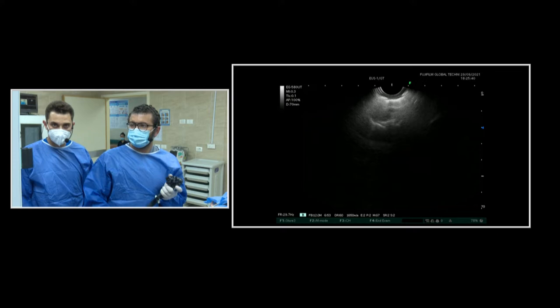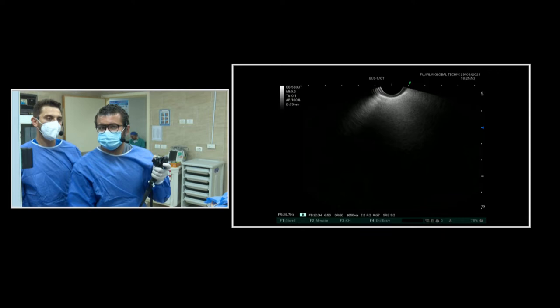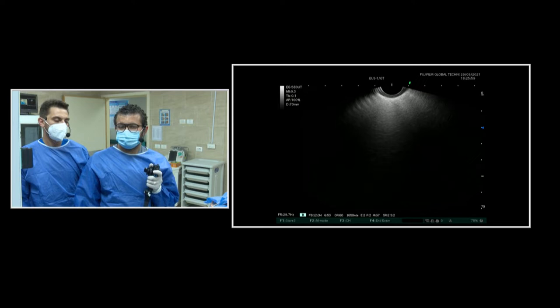So I referred this case to my colleague Dr. Yunan. Good morning, Dr. Yunan. This case, as I said, was referred for ERCP for obstructive jaundice. We saw the papilla — it was suspicious, it was bulky — and the lower CBD was totally occluded. So we're suspecting malignancy. We're referring it to you for EUS. Let's take a look.